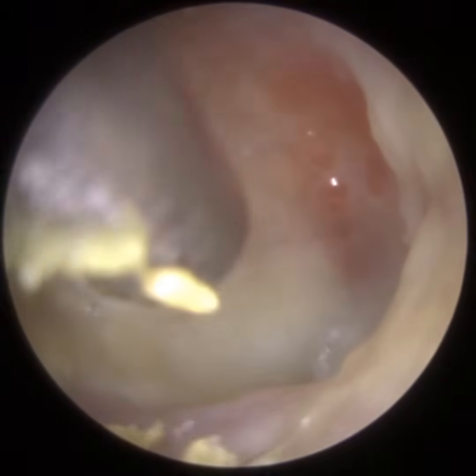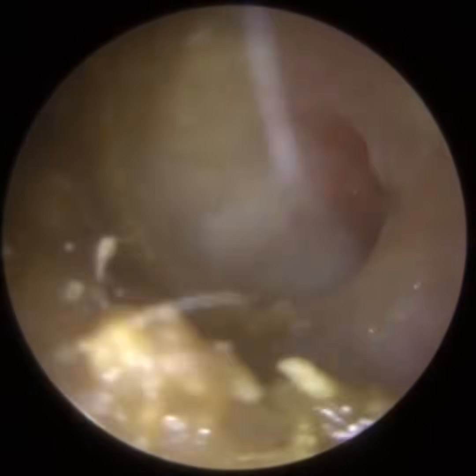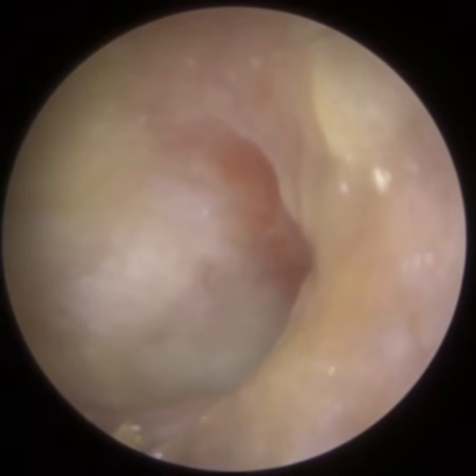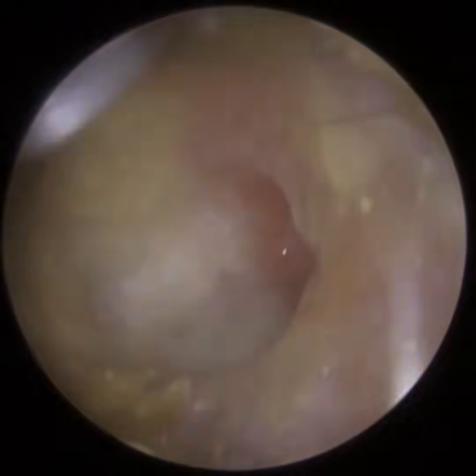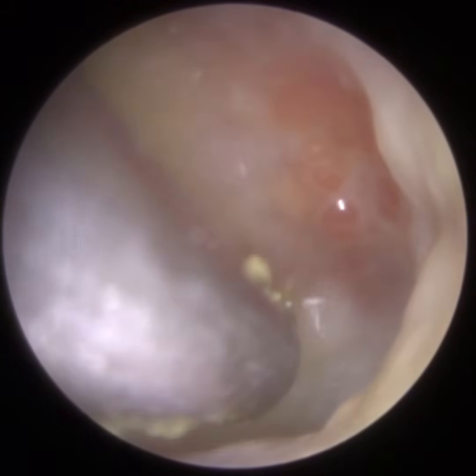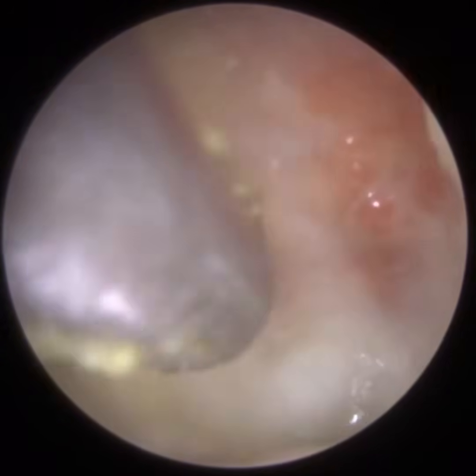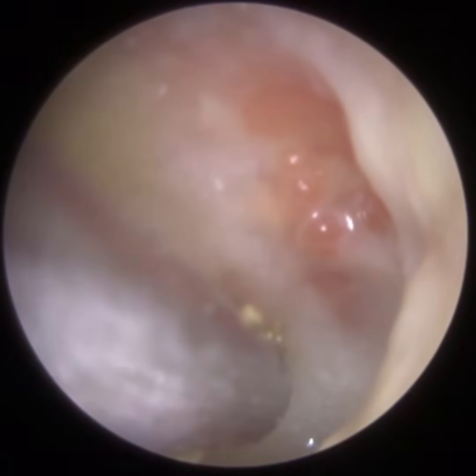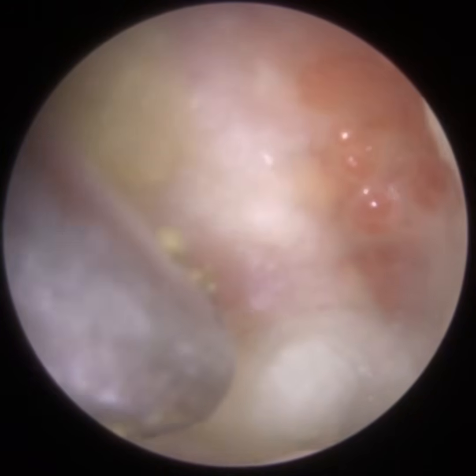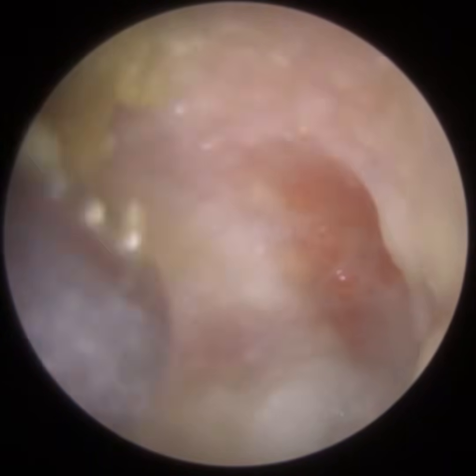Now, this is not the first time the patient has had granulation tissue. They have been seen by ENT in the past, and they have, I believe, attempted to cauterize this. Cauterizing is almost the burning of this connective tissue, and it kills all this connective tissue formation. And when it reheals again, we hope that the granulation tissue doesn't occur. However, that's not the case in this particular patient.